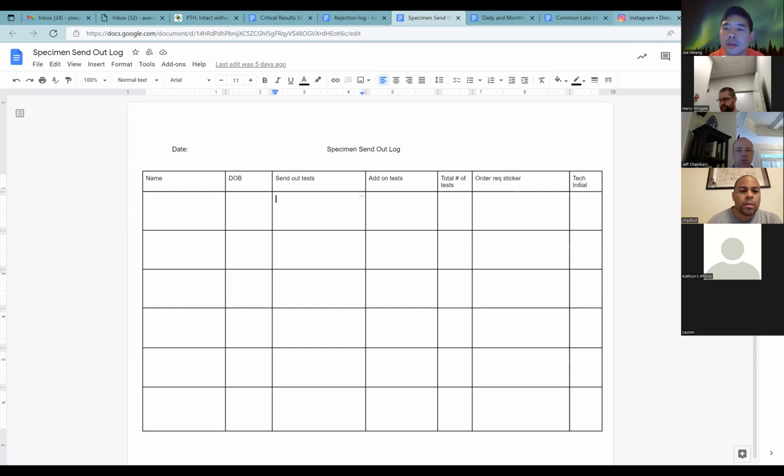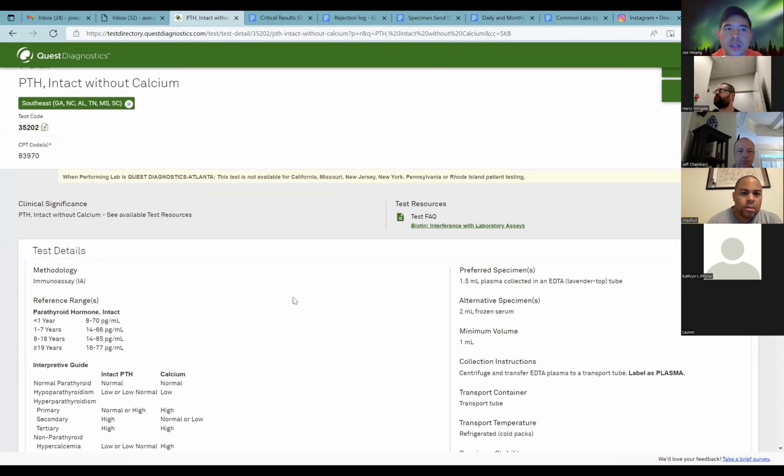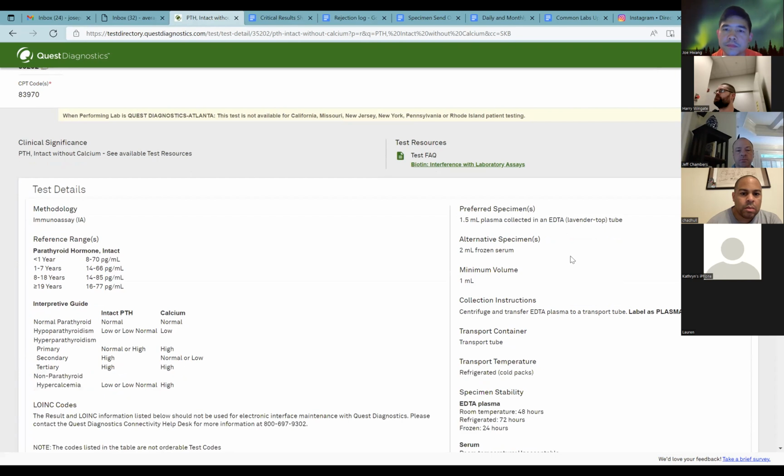Get on that. And then let me just go over a few more things. We're still getting some questions, especially when these nephrology patients come in. We've had a few of those who are repeat patients. And I think this one's probably the most confusing one, so I'm going to go over this. PTH intact. If it just says PTH intact, you order the one without calcium. I believe there is one that says PTH and calcium. So PTH without calcium is the right one to order. Notice that it's plasma collected in EDTA lavender top tube.